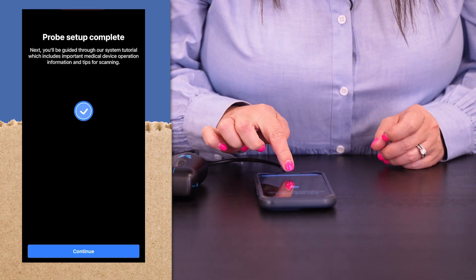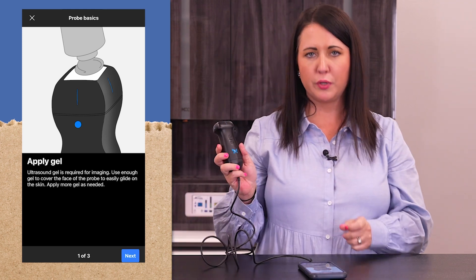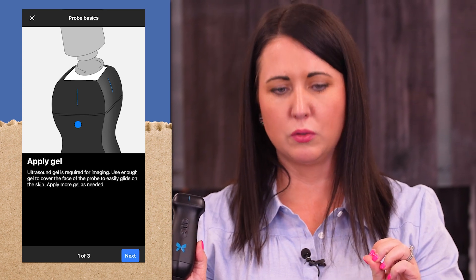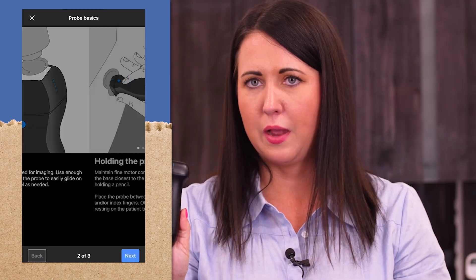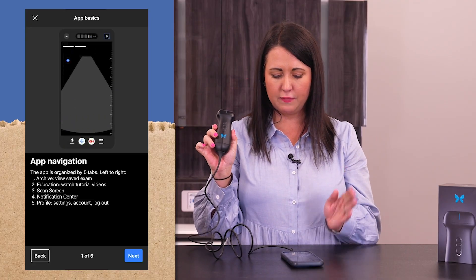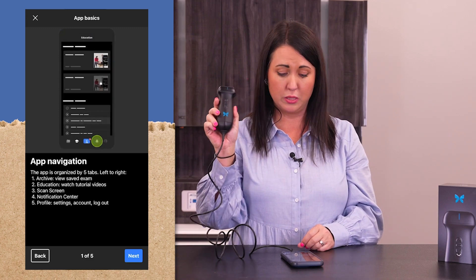We are in the app. We're going to click log in, and we have set up the probe. What I love about this is it walks you through the tutorial — very basic starting entry level ultrasound. So apply gel, how you hold the probe, how you position it, and image orientation. It's got markers on the probe so you know where you're supposed to be scanning on the body. This is walking us through app navigation, giving you the very basics of what you need to use the application with the probe. Very nice. Walks you through step by step.